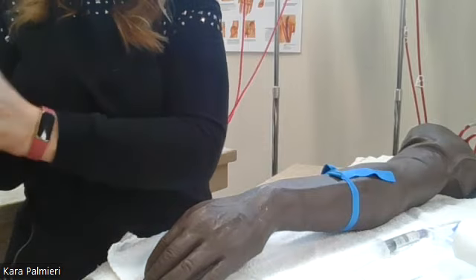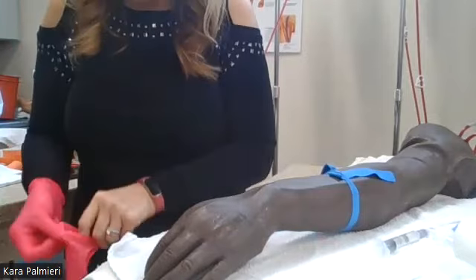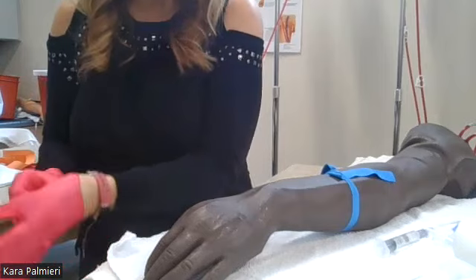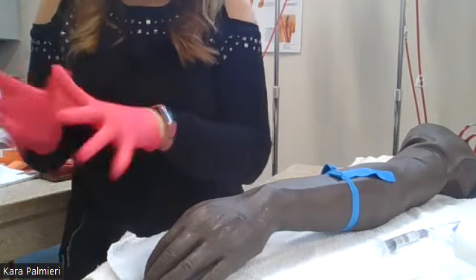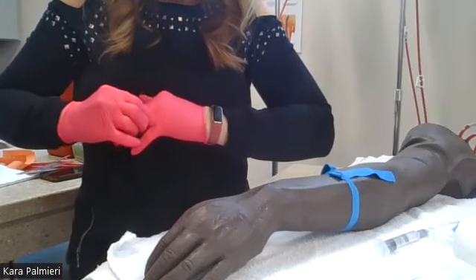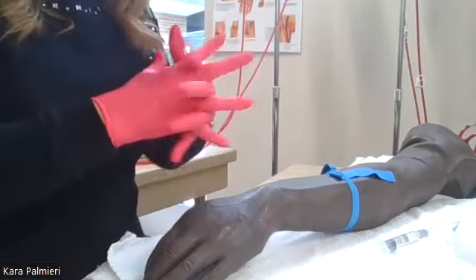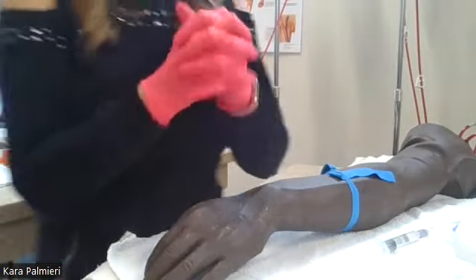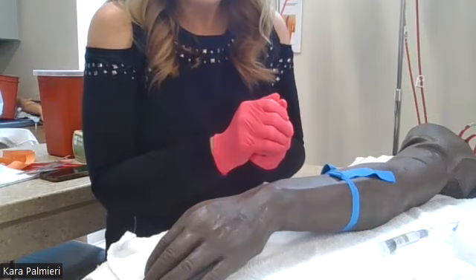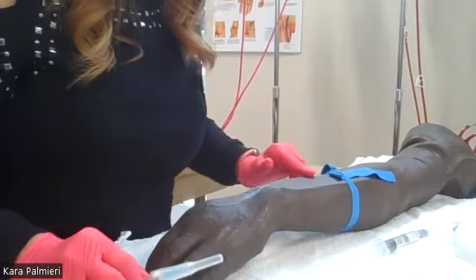And I'm letting my patient know the whole time what I'm doing. I didn't mention earlier, but personally, I have a 2-stick max. If I can't get it in 2 sticks, I'm not going to get it. And I'm not going to subject the patient to any more torture from me. So that's just my rule. But the more you do this, the better you get at it. And you will be the person that everybody comes to get because you'll be able to get the IV in. Okay, I'm ready to stick.